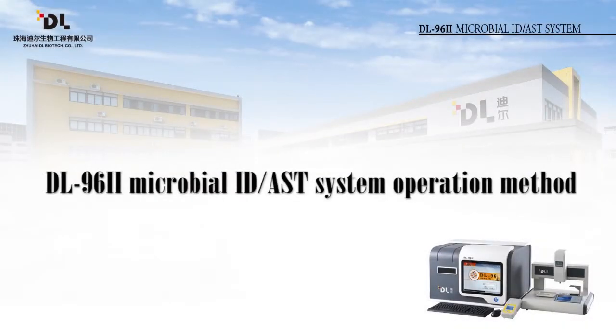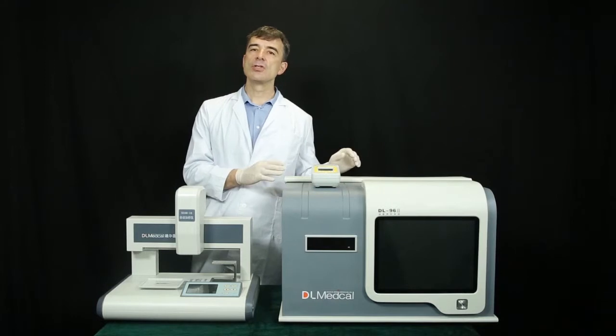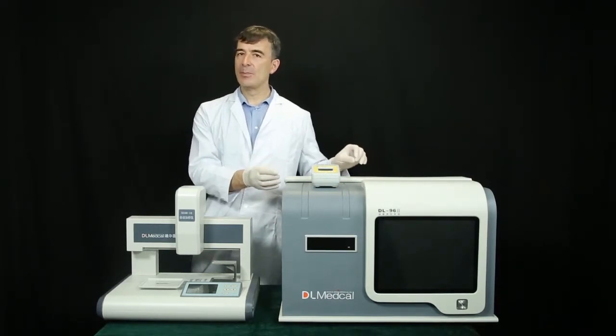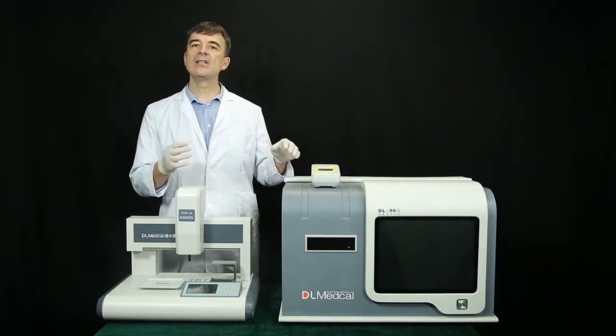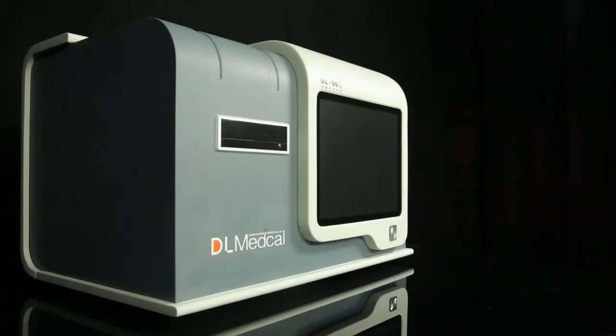Section 3. DL962 Microbial ID-AST System Operation Method. When we finish adding auxiliary reagent to the test card and wait for its finishing reaction, the test card must be put in the Microbial ID-AST system to analyze at once. Next, let's learn how to install the DL Microbial ID-AST system.